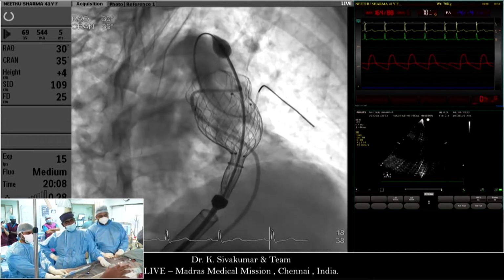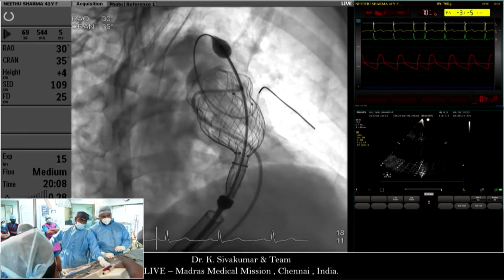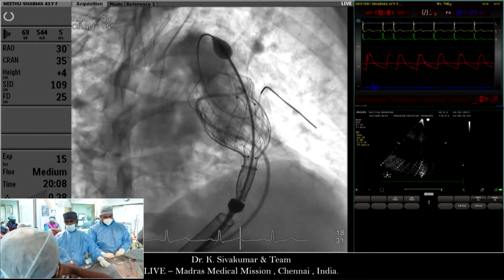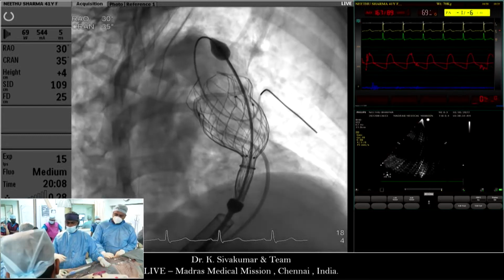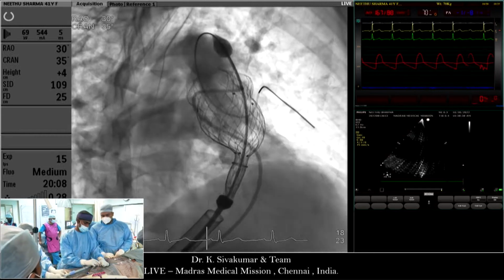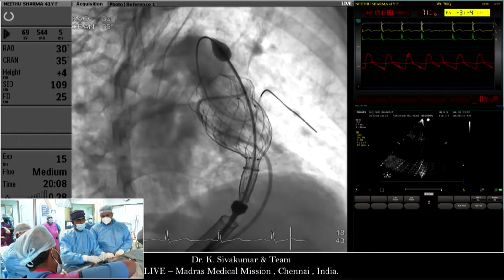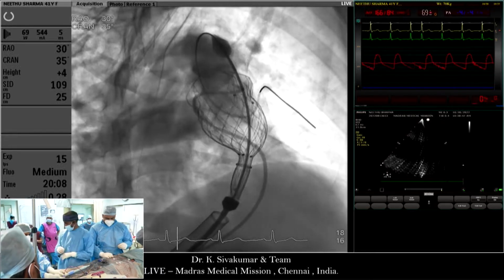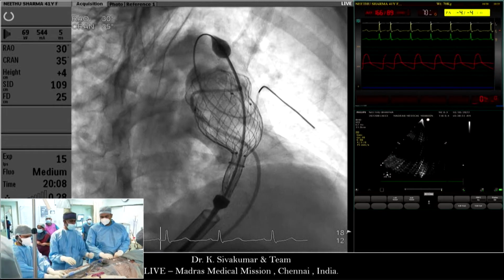I was listening to Ahmed where he was mentioning it is oversized by length or oversized by diameter. Ahmed? Well, to me, I don't think this is oversizing. In my opinion, I think it is oversized. Is it diameter or length? I wonder about this at this stage for learning. Can you retrieve the valve completely, Shiva? Let me ask a technical question, Ahmed.